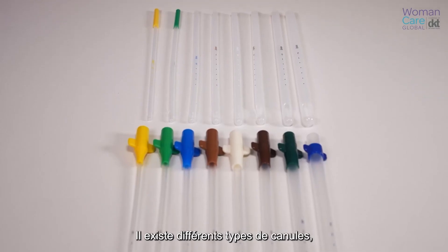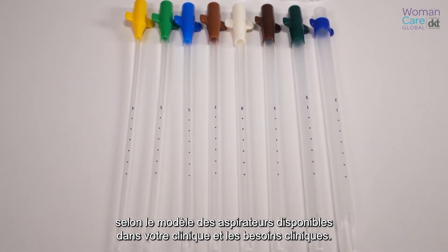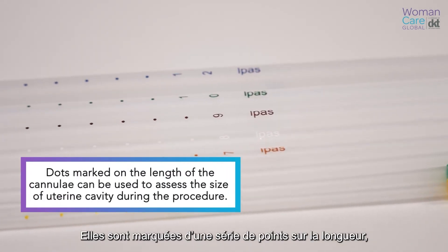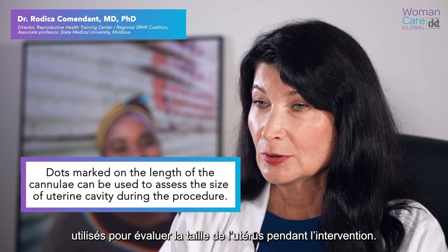There are different types of cannula depending on the model of the aspirators available in your clinic and the clinical needs. They have dots marked on the length which can be used to assess the size of the uterus during the procedure.